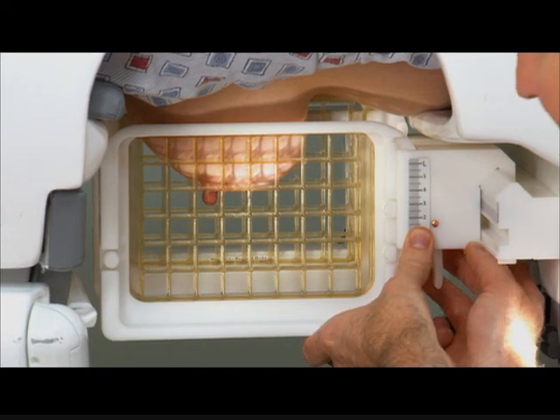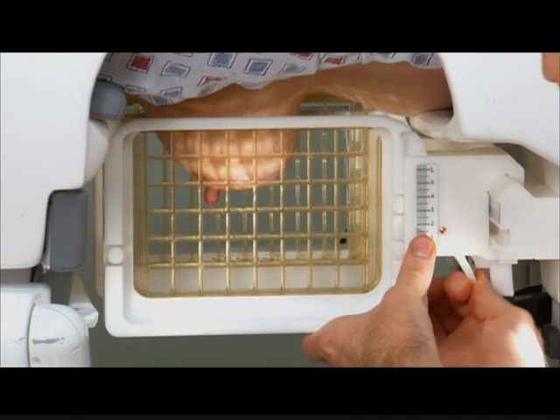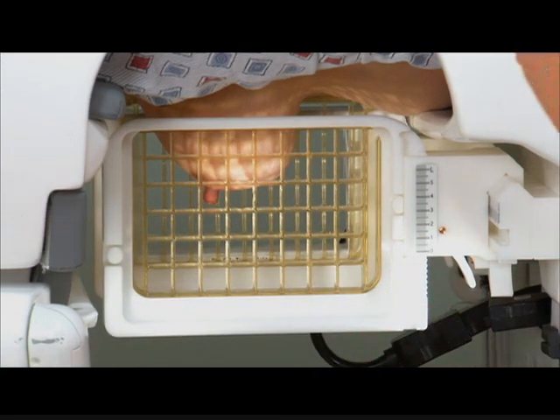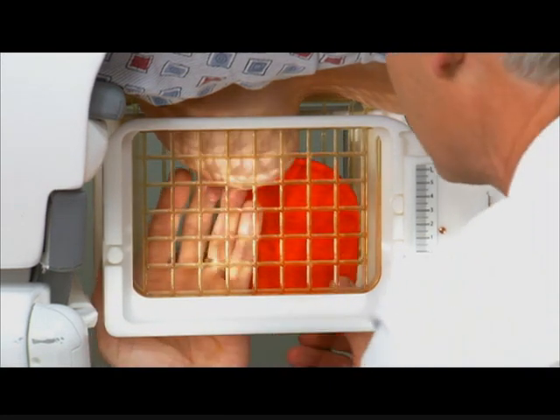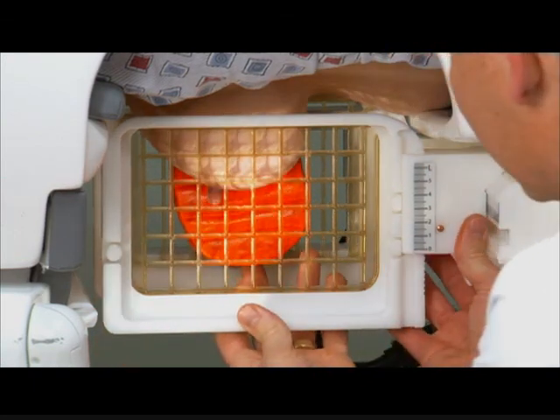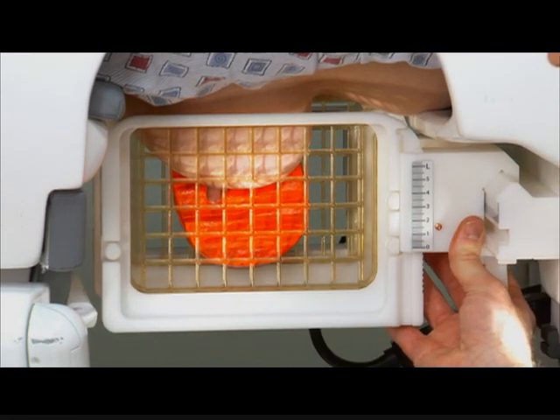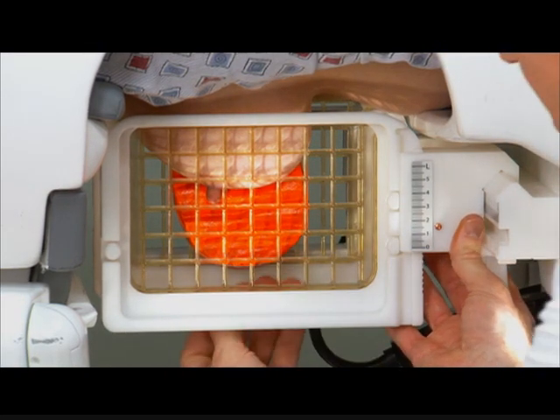You're the one who knows best where the lesion is. You know the issues at hand insofar as getting appropriate compression to facilitate your biopsy. If there's an anterior lesion, you either position the patient appropriately, or if you have grids that are mobile, you can position the grids to more optimally compress the anterior breast versus the more posterior breast.